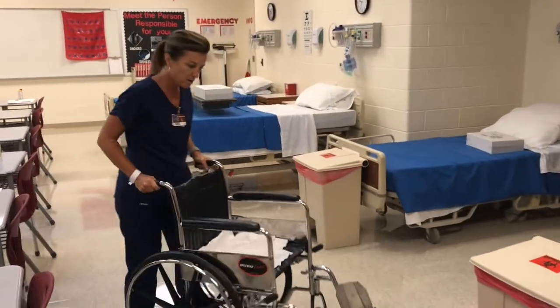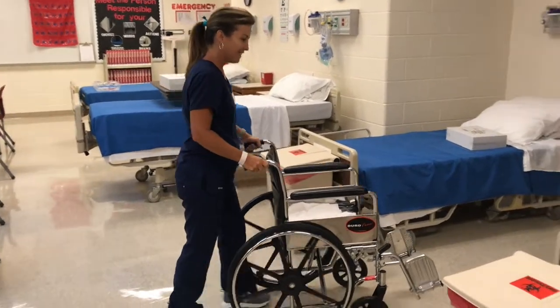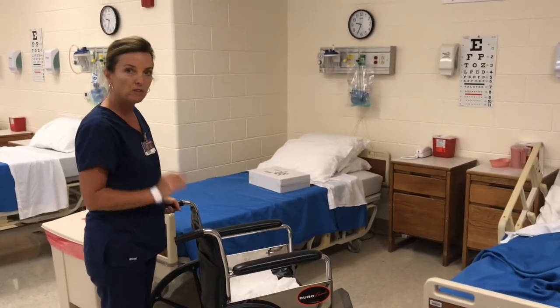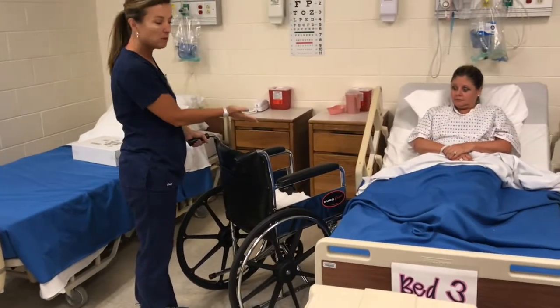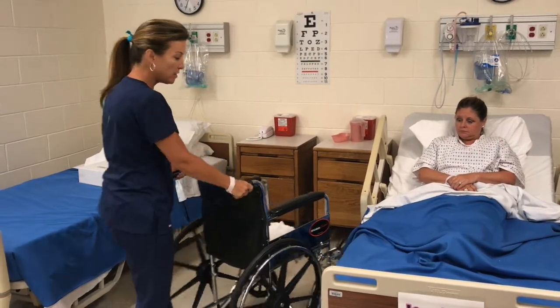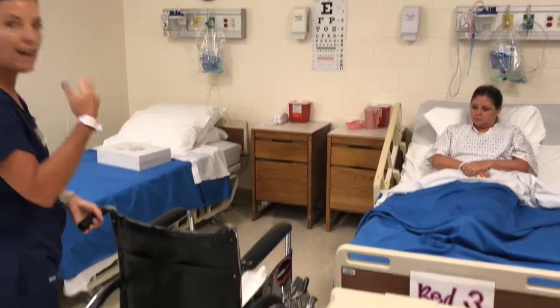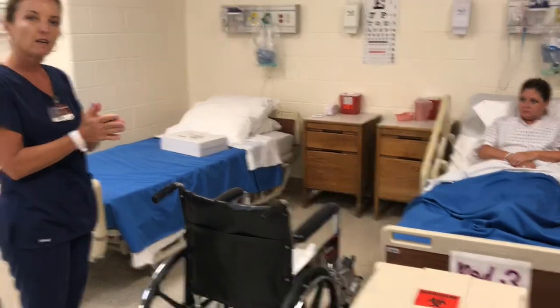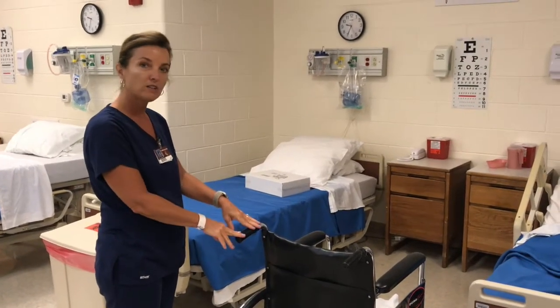Take my wheelchair. Now when you take the wheelchair into the room, this is what you do not want to do — pushing it right up by the patient at the head of the bed because the patient has nowhere to put their legs. So you're going to take your wheelchair in and put it towards the end of the bed so the patient has room to move around. These skills are intermixed, so if you've got your skill sheets, lay all three out so you can keep up with where I am. Right now I'm on the wheelchair safety skill sheet.